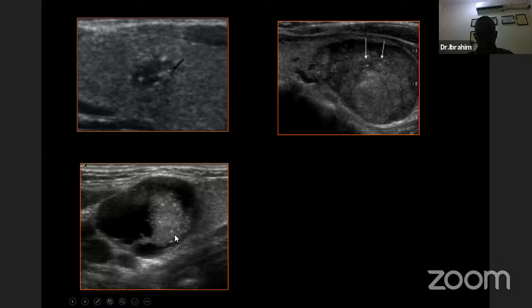Follicular carcinoma is the second most common type of thyroid cancers, well differentiated and developed from follicular cells. Solitary, mostly some of them are well defined, well encapsulated, and less invasive, whereas others are not encapsulated. It means widely invasive tumor. Sonographically, might show irregular margins with thick irregular halo and tortuous internal blood vessels.